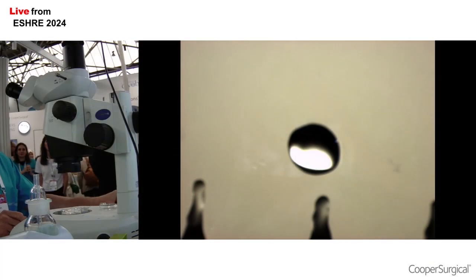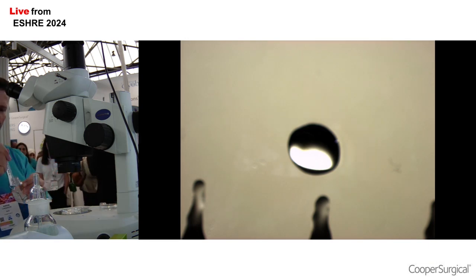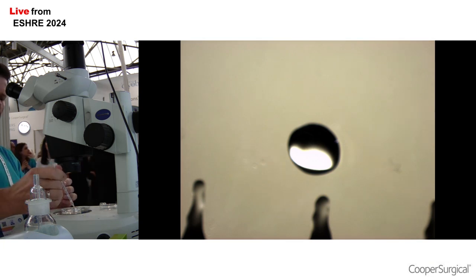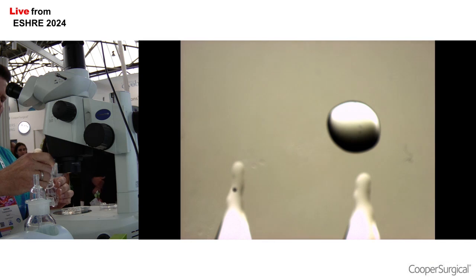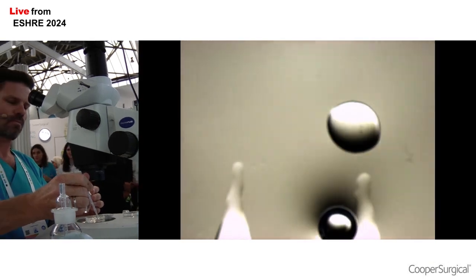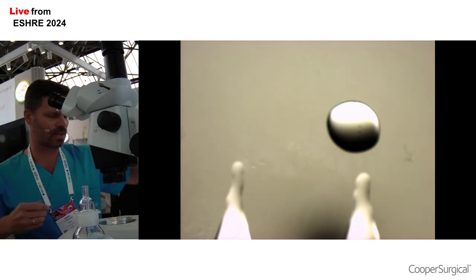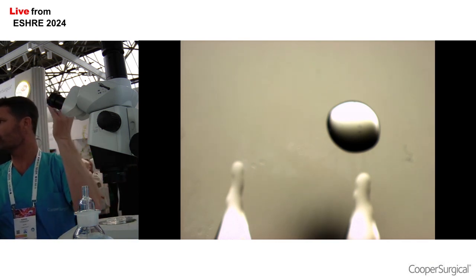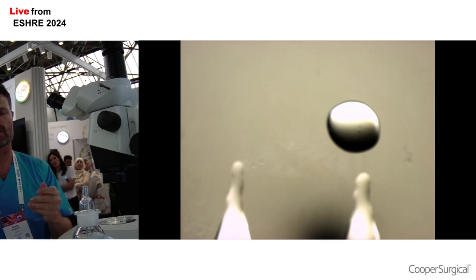What I'm going to do now is place some oil on the dish so we can prevent any evaporation. So we cover our dish with oil. Okay, so that's all done. Now we can be calm. We don't have to worry about any evaporation or any changes in osmolarity. Now I've got here my prepared sperm sample at the normal concentration that you would use for an ICSI. So just like you're going to do a normal ICSI.